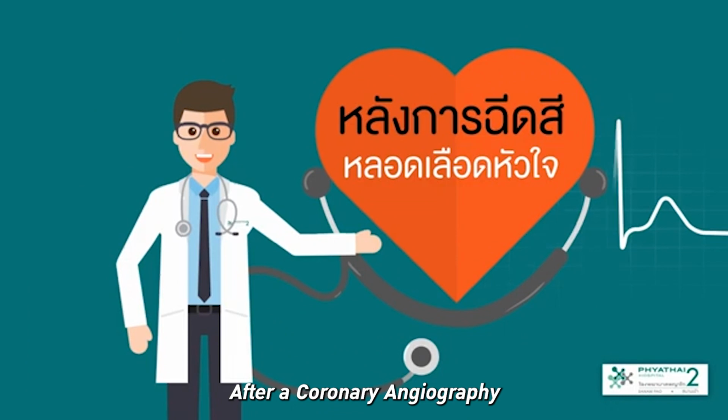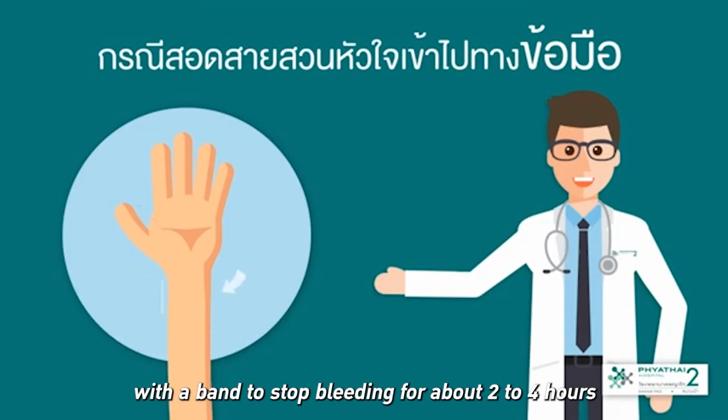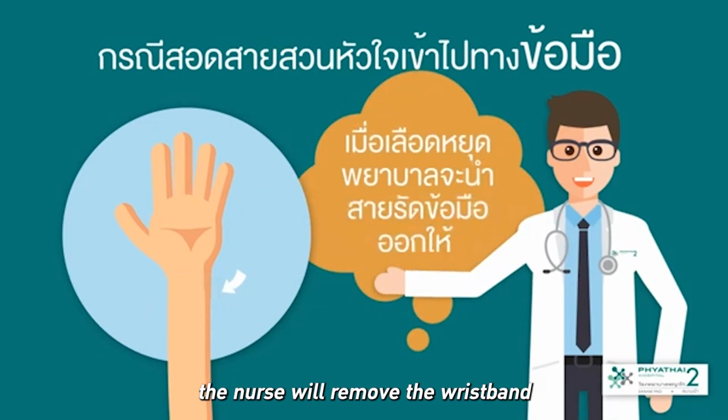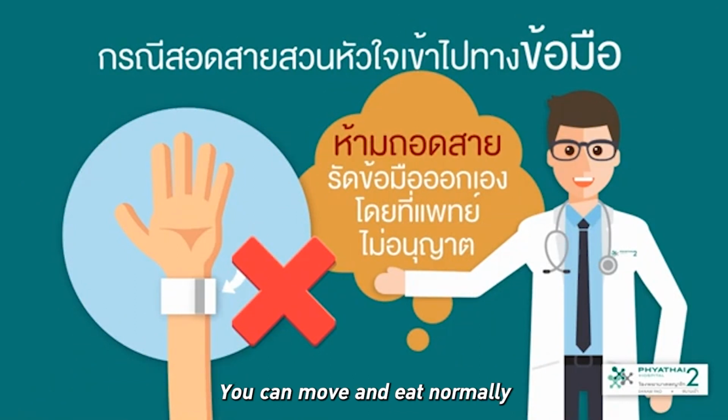After coronary angiography, in case the catheter is inserted through the wrist area, it will be compressed with a band to stop bleeding for about 2 to 4 hours. When the bleeding stops, the nurse will remove the wristband. Do not remove the wristband without the doctor's permission. You can move and eat normally.